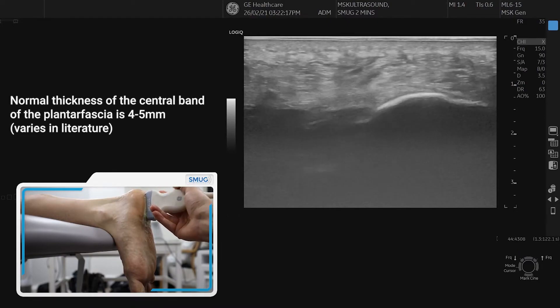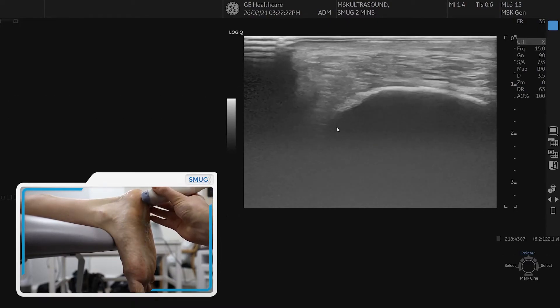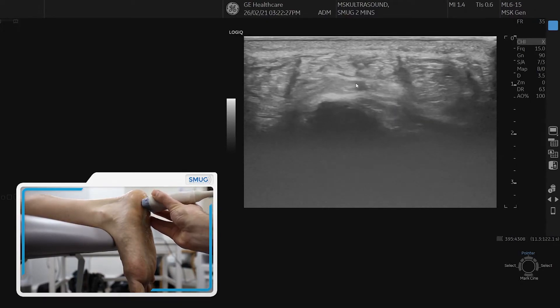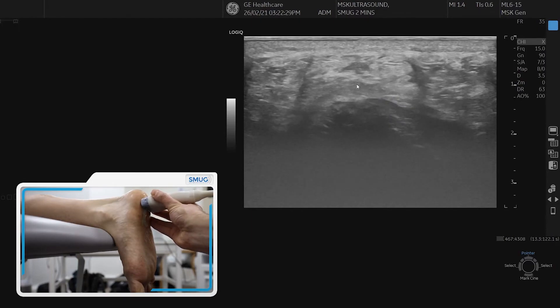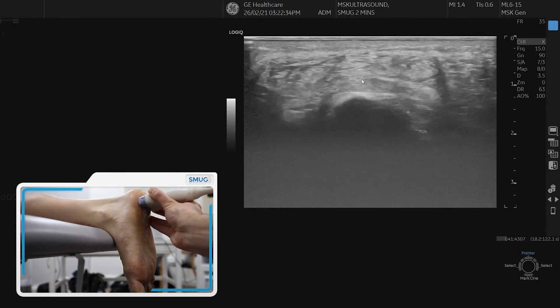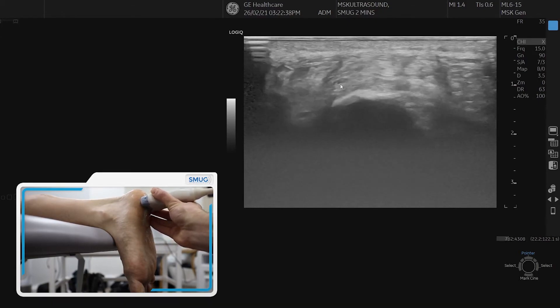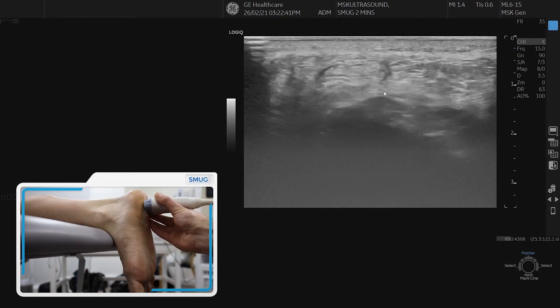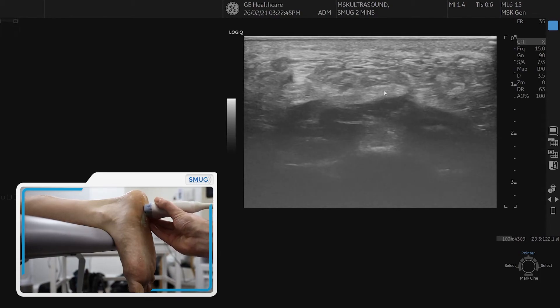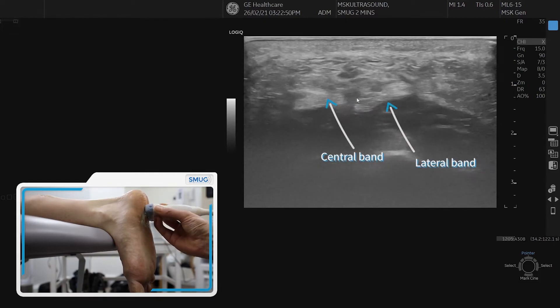In transverse section we can visualize the calcaneum, and as I move more distally you can see the plantar fascia coming off the calcaneum. Most medially you can see the medial calcaneal tubercle with the band on top. Moving laterally, there is a hyperechoic region which is the lateral band of the plantar fascia, and that follows up towards the fifth metatarsal.